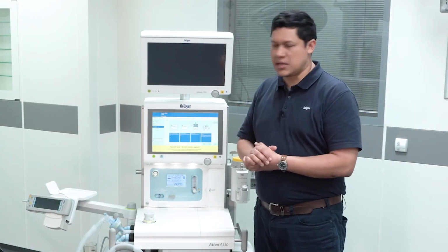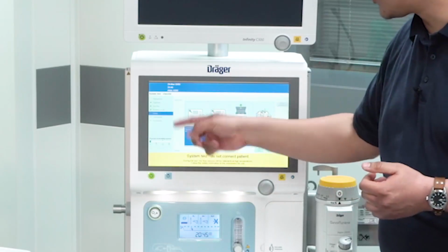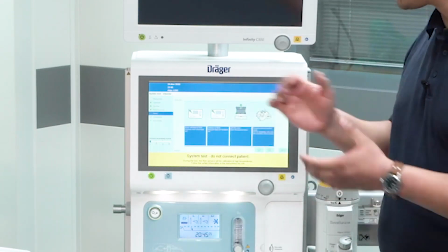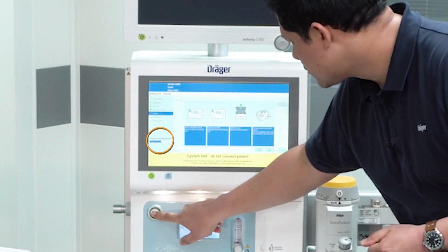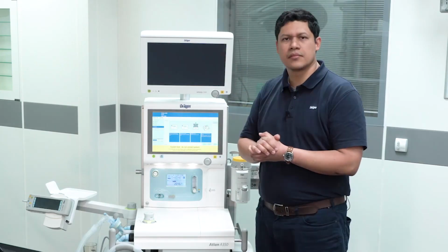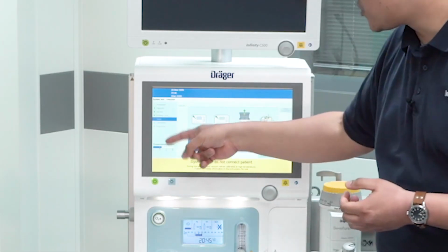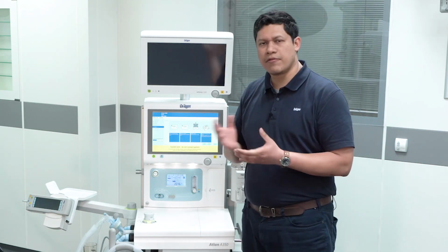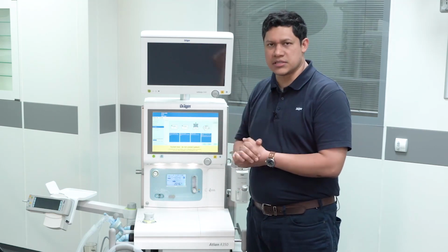The next group of tests are related to the valves. First, you will have to verify on the electronic manometer that when you press the oxygen flush, the pressure will not rise above 45. Once you have released the oxygen flush, you have to make sure that the pressure does not go down below 15. Following, you have to lift the APL valve to alleviate the pressure in the system.